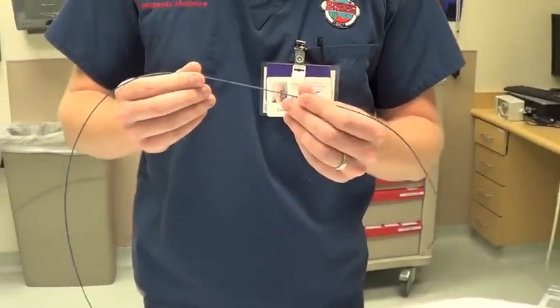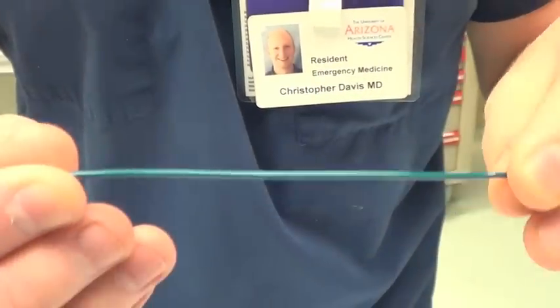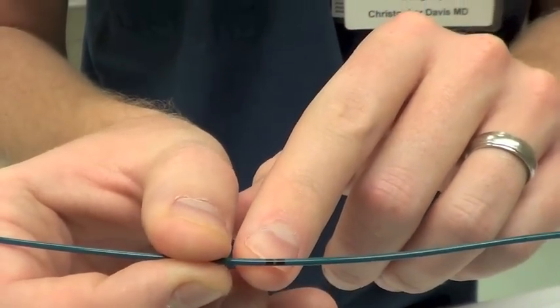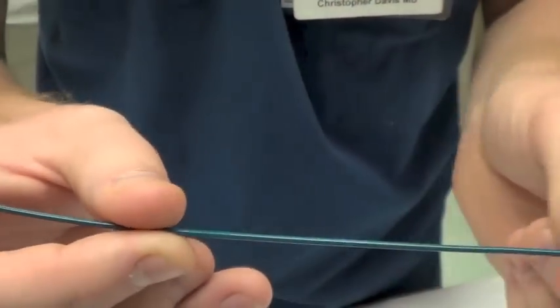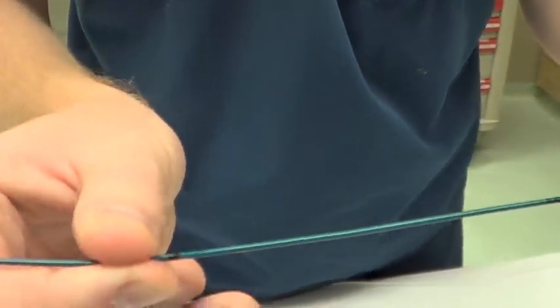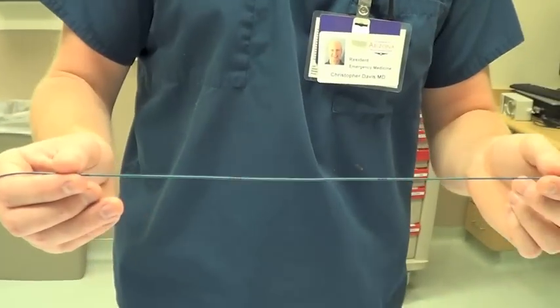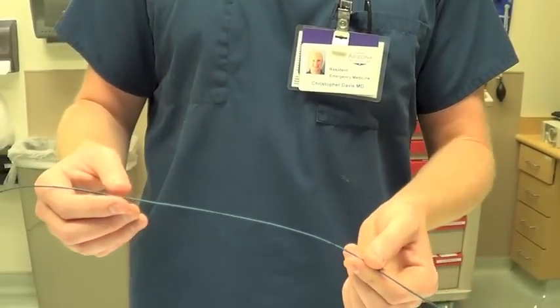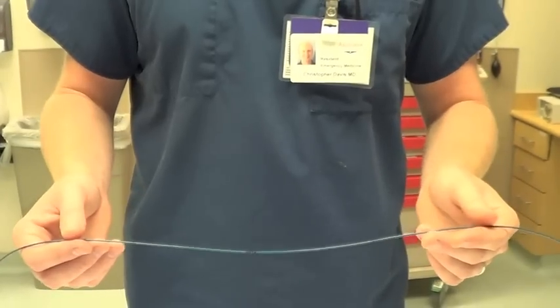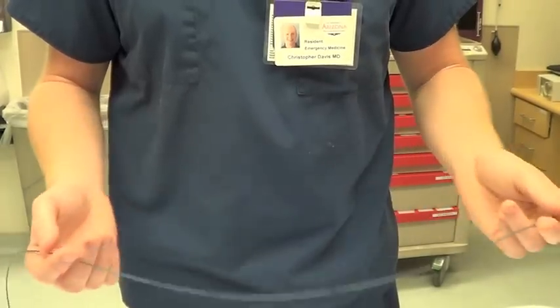These wires have little nicks on them. The double nick represents 20 centimeters, the triple nick is 30, then 40, and a big black one for 50. Most patients, you'll find the pacer properly seated in the apex of the right ventricle somewhere between 30 and 50 centimeters. If you get past that, you need to be concerned that you might be coiled in the right ventricle, which could be a nidus for clot.